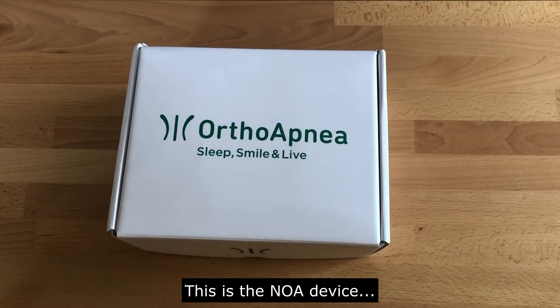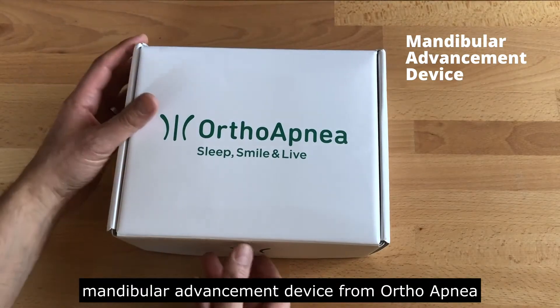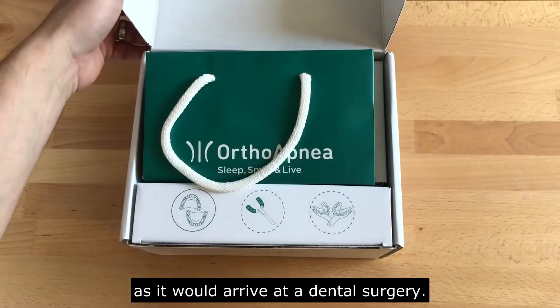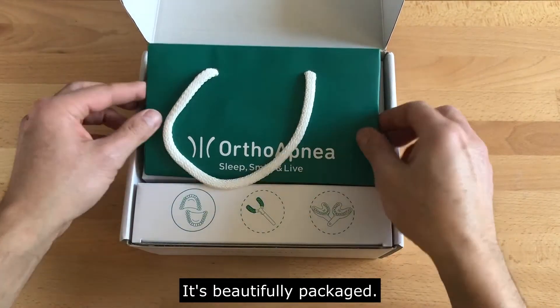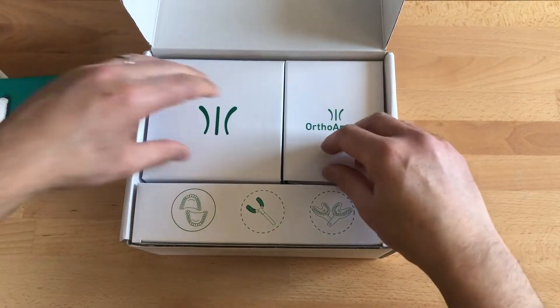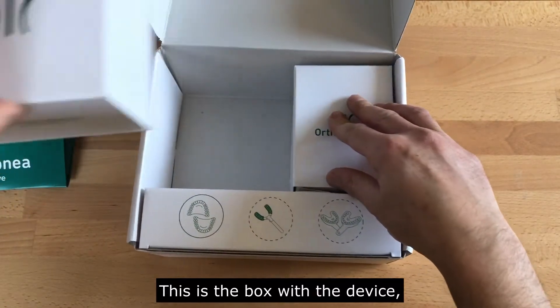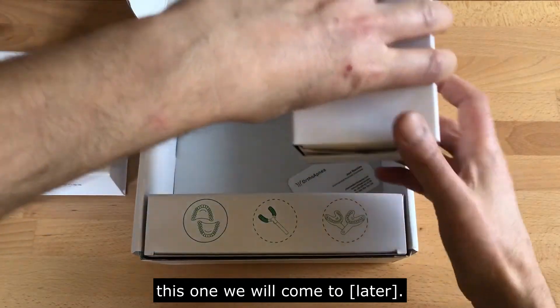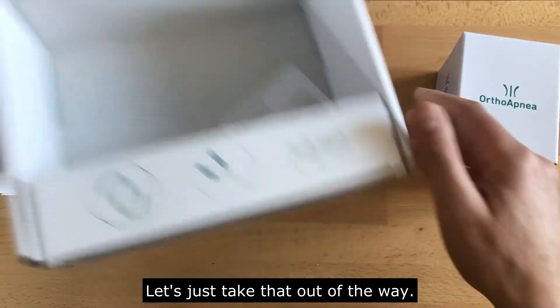This is the NOA mandibular advancement device from OrthoApnea, as it would arrive at a dental surgery. It's beautifully packaged. There's a bag for the patient to take the device away in. This is the box with the device.